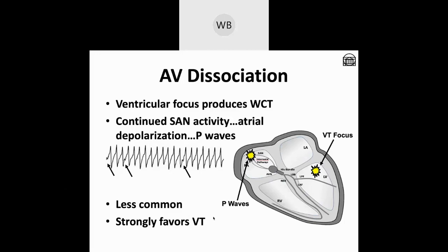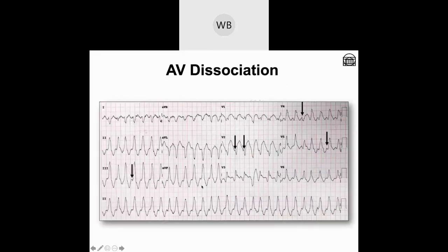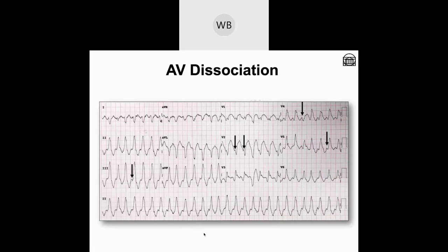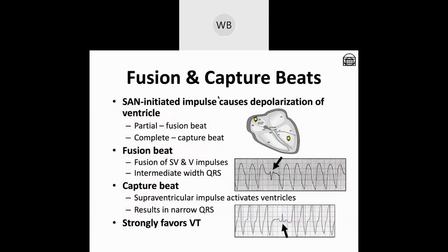The medical literature says AV dissociation is less common—I would actually disagree with that. If you know what you're looking for and have the patience to look for it on a monitor, you may see it more often. When you see it, it strongly favors the diagnosis of VT, so it's definitely worth knowing about and looking for. Here's a 12-lead ECG showing evidence of AV dissociation in several areas, with small P waves visible in multiple locations within an otherwise wide complex tachycardia—strongly suggesting ventricular tachycardia.